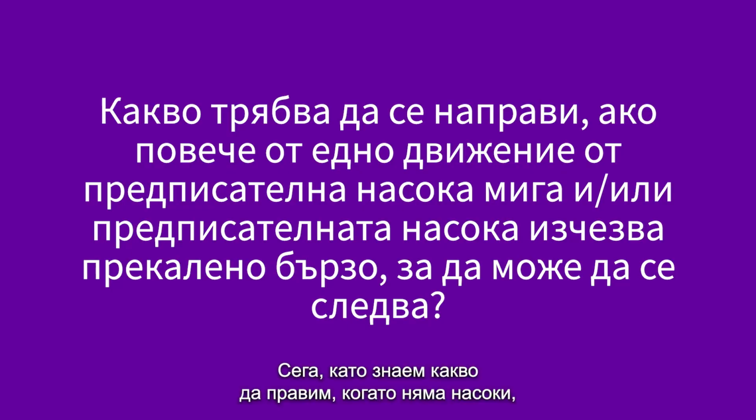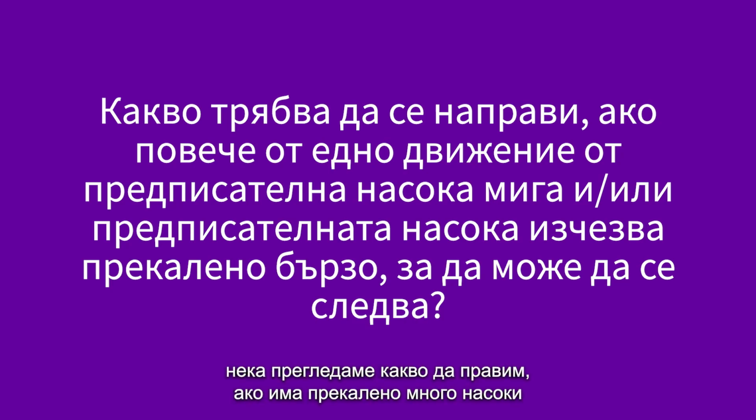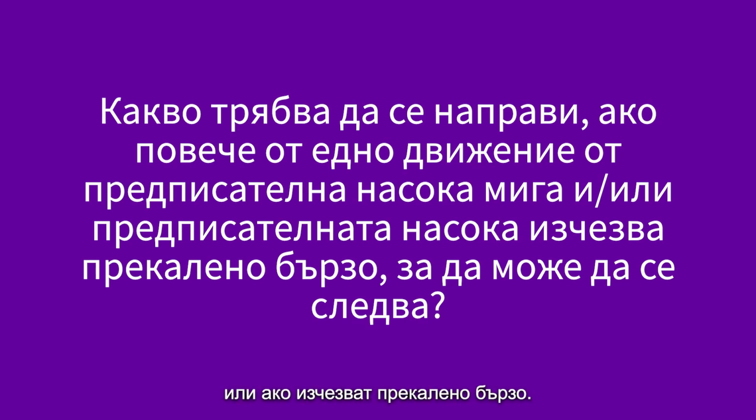Now that we know what to do if there is no guidance, let's review what to do if there is too much guidance or it disappears too quickly.